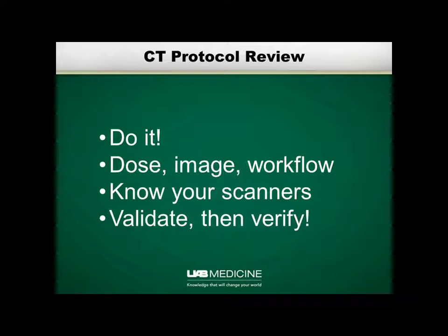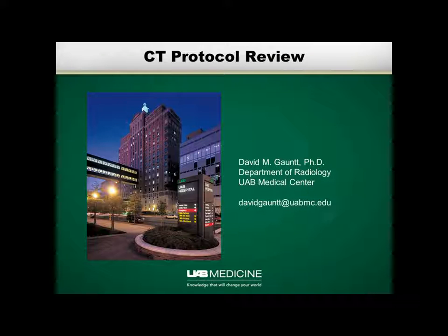One of the things I've discovered with this electronic verification is that when I tell the techs to get a particular protocol onto a scanner, and then I run the verification, I give them a list of the mistakes they made, and they correct those, and I run verification again, and then I have to give them another list of mistakes. It typically takes 2 or 3 go-rounds to get it all correct. Do not assume that just because it's on a piece of paper in someone's office that it matches what's on the scanner. Thank you for your attention.